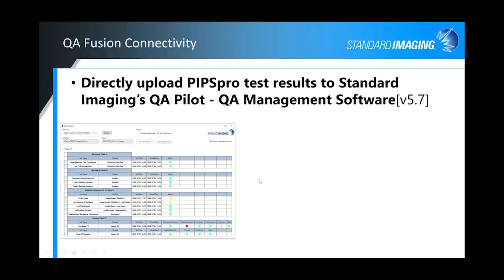But a couple of last points that I had mentioned, our QA Fusion component, which basically, again, is our connectivity of our PIPSpro directly to our QA Pilot QA management software system.